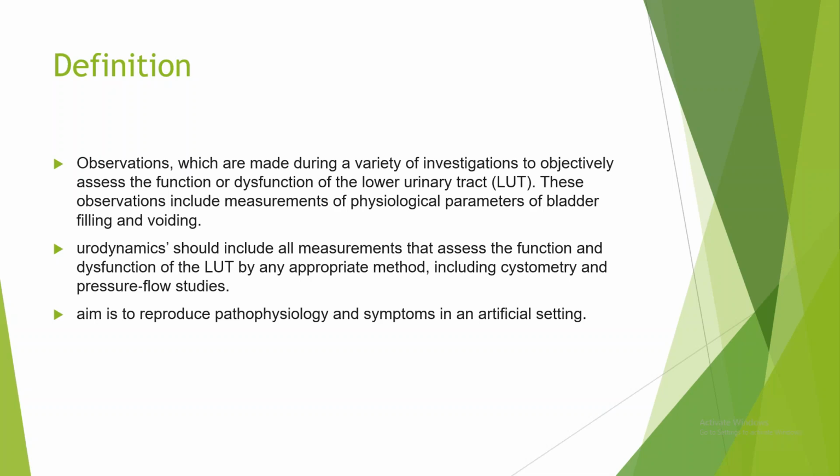Urodynamics is done to assess the function or dysfunction of the lower urinary tract. These are various investigations that come under urodynamics, like routine urodynamics, ambulatory urodynamics, video urodynamics, urethral flowmetry. So there are different studies which come under urodynamics. These are the observations made during a variety of investigations, and with these we assess the lower urinary tract functions objectively and not subjectively.